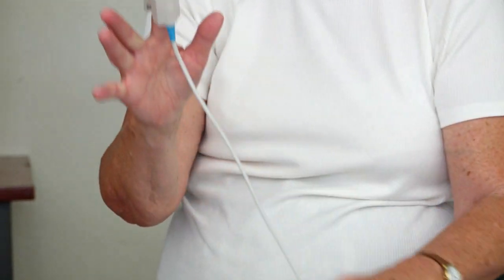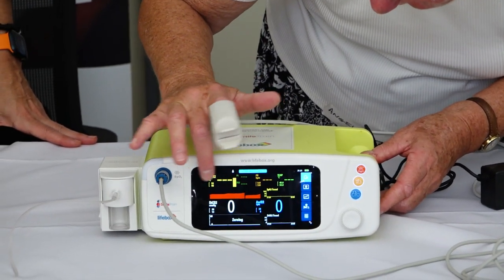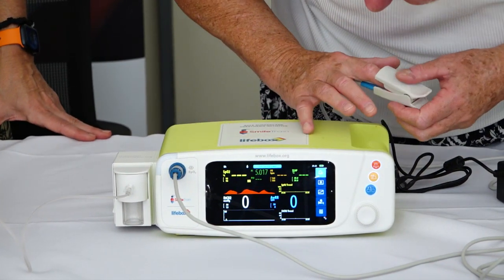Before, especially if you've had anesthesia, it just goes on a finger, and very shortly now you should see my pulse coming up here, and the oxygen saturation in my blood. I think I'm alive.